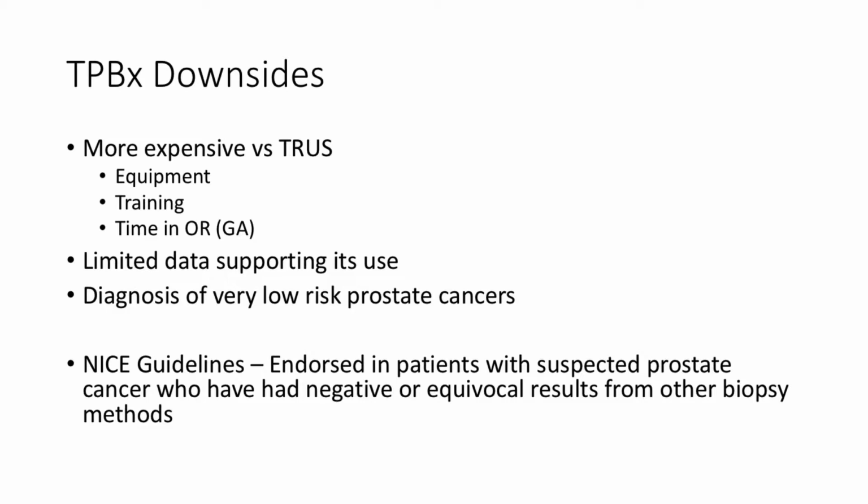Yeah, well, that's a good question. It does take up OR time and does increase the wait list, but we do it in a system similar to what you have in UBC, where it's quick turnover, that allows for up to 10 to 14 biopsies done in a day, and we try to list them all so that patients are fast-flowing. But there is an issue: it increases the wait list. That's why it's more resource-intensive.